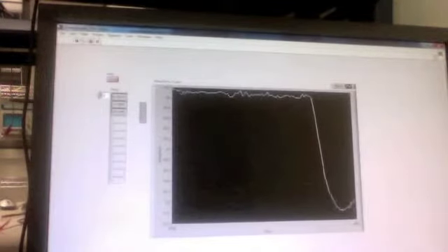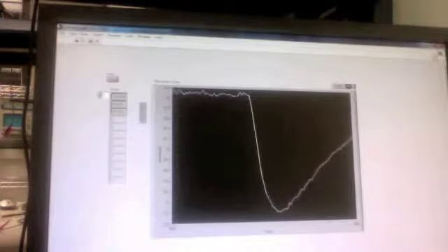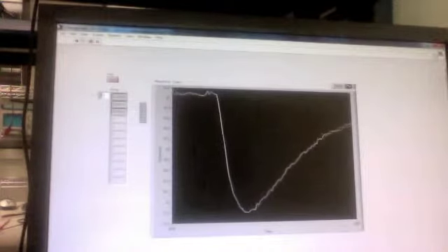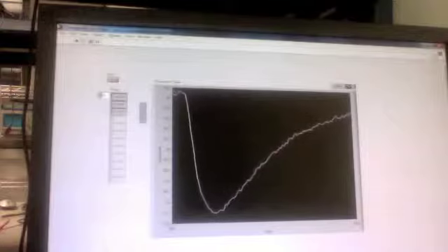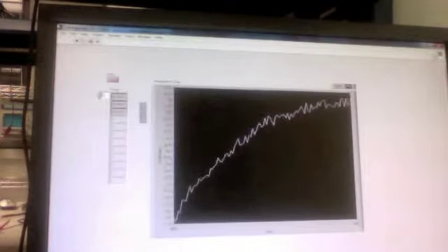There it goes. The temperature drops rapidly, which means that a seizure has been detected and cooling has started. The reason it took so long in this case is because the device is only reading from the neural electrode every 5 seconds, so we just turned it on at an inopportune moment.